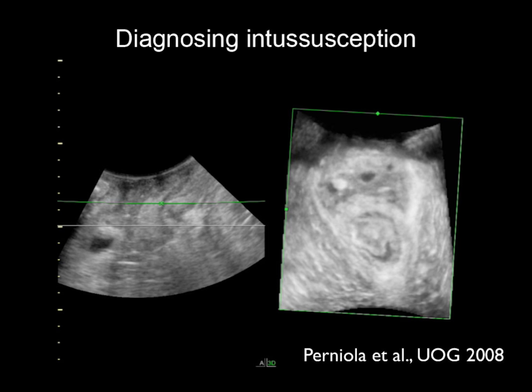What happens there is that this lady is pushing small bowel into her anal canal. She's inverting the rectal ampulla, and in that process, the anal canal changes from tubular to something more resembling a cocktail glass, although it's not that cocktail glassish here, because that trumpeting, that opening up of the anal canal is not quite so marked here. In the axial plane here, you can see an abnormal levator, and you can see how lopsided things are. These are all findings that would normally be missed.